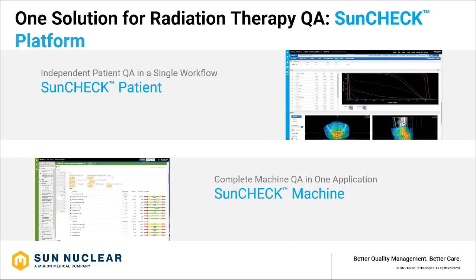So moving on to the webinar itself. SunCheck is a single QA platform which incorporates all aspects of patient QA into one single workflow using one single application. And we'll see later on how DoseCHECK forms a part of SunCheck Patient. Within SunCheck itself, you also have the ability to perform and record all machine QA related tasks using our SunCheck Machine application.